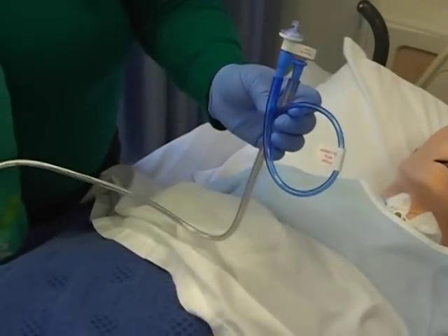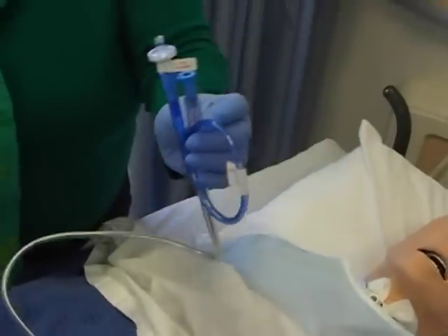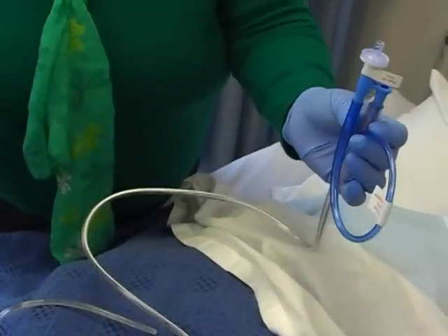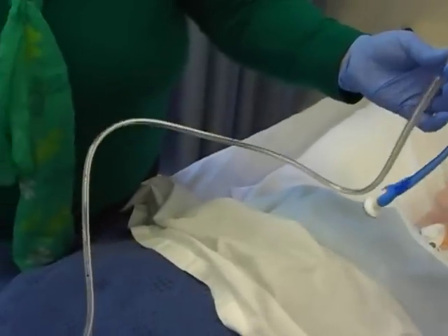If the NG tube is being used for medication purposes, you would instill the medications and then cap it. This is how it comes in the package.